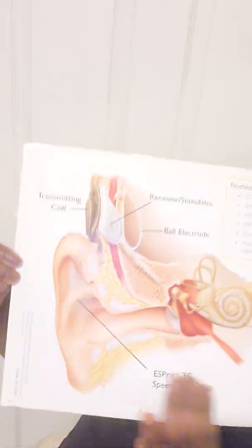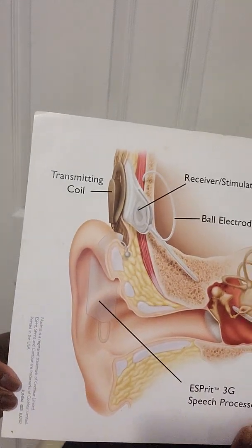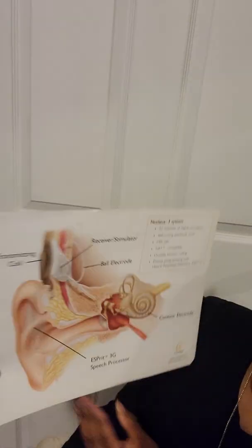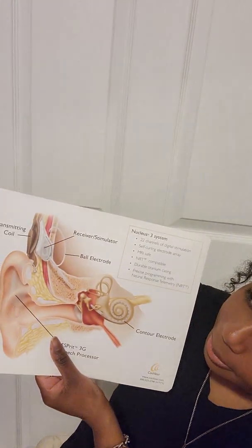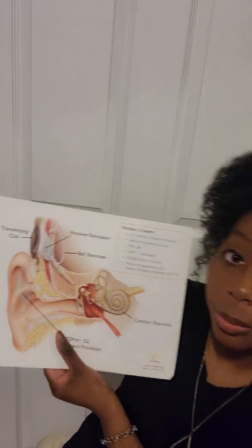So I have a little diagram here. And then again, you can also do more research to just learn more about how this works. So this is what cochlear looks like. So this is the outside part. My ring. I got small fingers. I was trying to fix my ring. Okay, so this is the magnet piece, the external part of the cochlear implant.